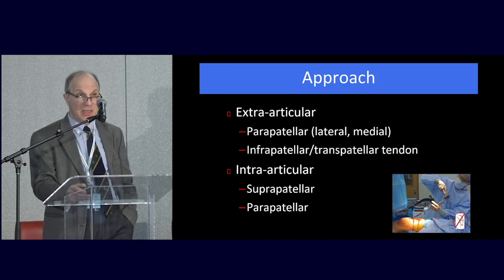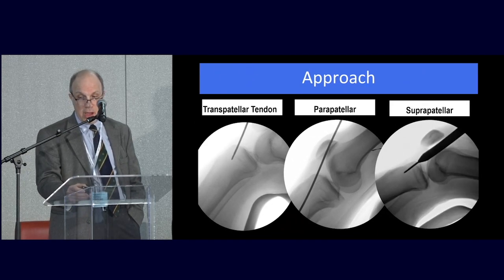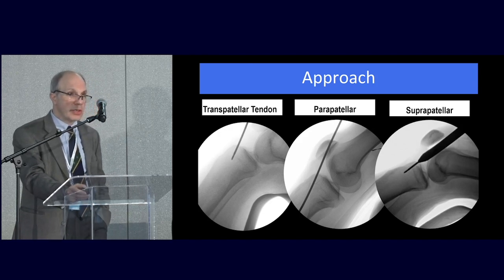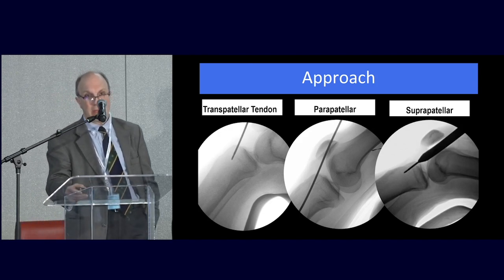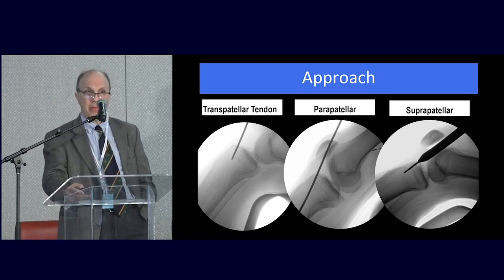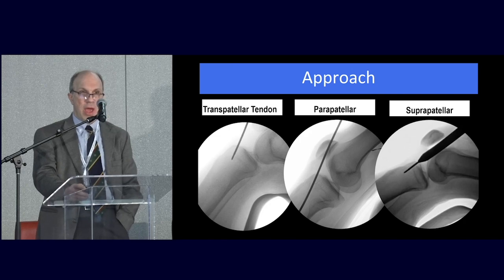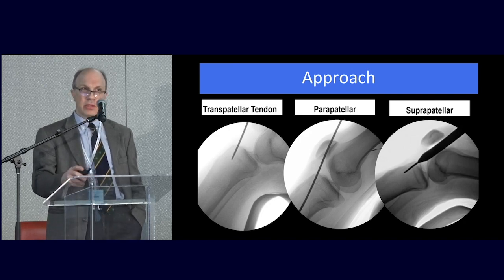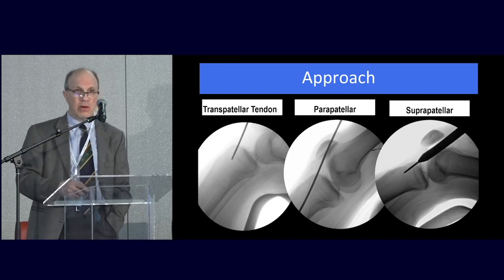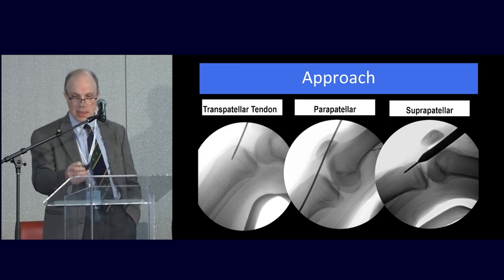The most common one that I see is the suprapatellar approach, as you have seen from Dr. Kretek. I'm with him. I'm always concerned, the younger the patient is, about putting anything in the patellofemoral joint, unless the patient is a young female with hyperlaxity. I think you are causing some damage. Again, I'm aware of all the literature that's building up that says there's no cartilage damage, but I still cannot understand that.